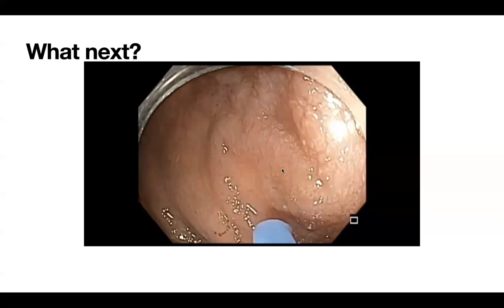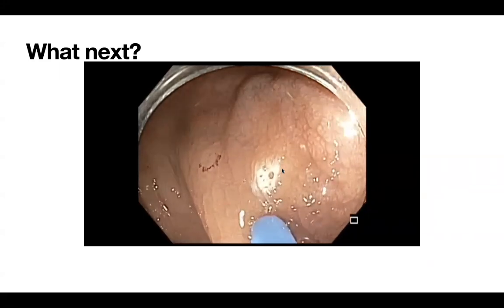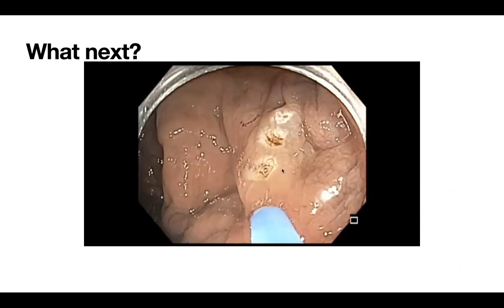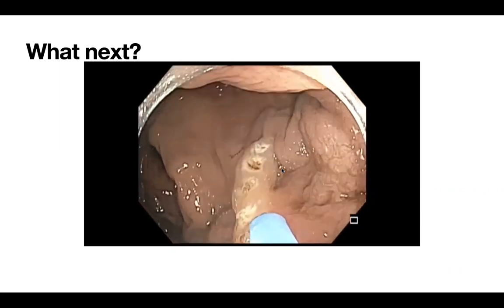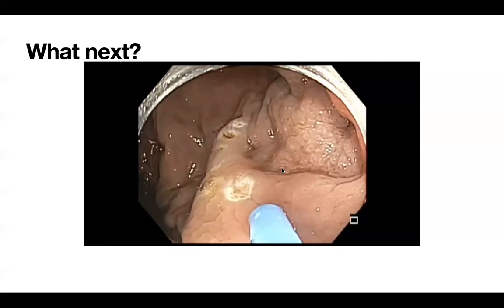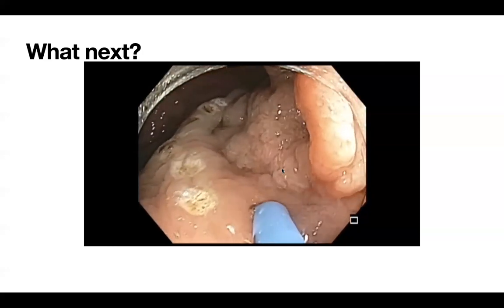And as I do the APC, you will see the mucosa to the right, which is a little bit abnormal, and to the left, that is normal. You can appreciate that, right? You can see here that the mucosa on the right side of the APC has a different appearance to the mucosa on the left side.